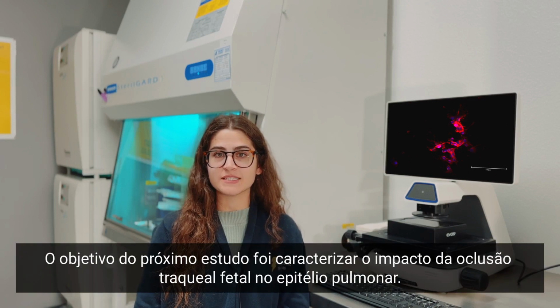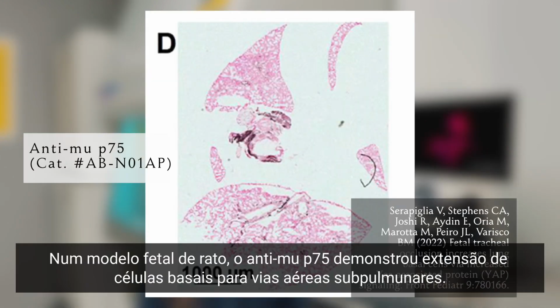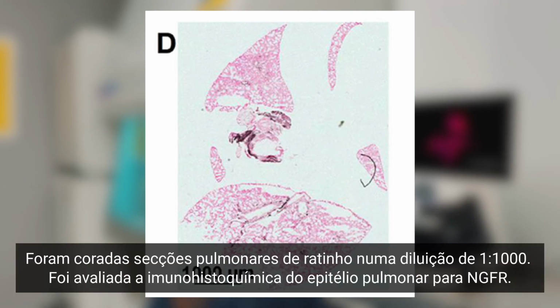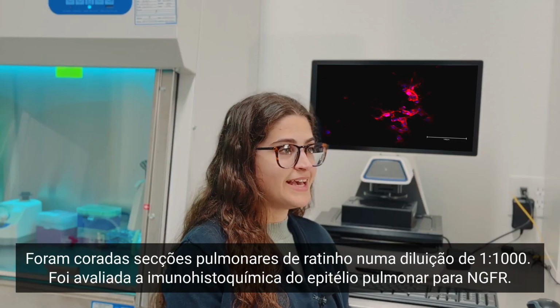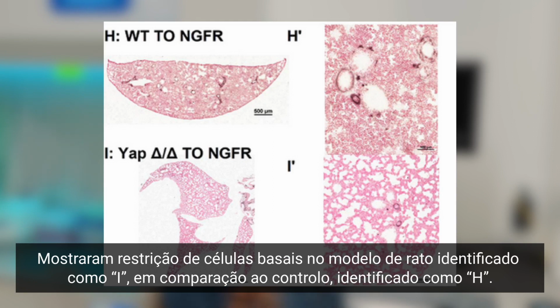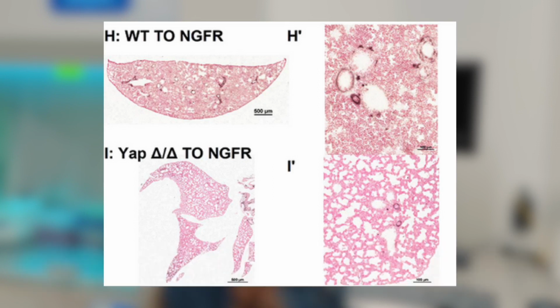The goal of the next study was the impact of fetal tracheal occlusion on the lung epithelium. In a fetal mouse model, anti-P75 demonstrated basal cell extension to subpleural airways. Mouse lung sections were stained at a dilution of 1 to 1000. Immunohistochemistry of lung epithelium were assessed for NGFR. They showed restriction of basal cells in the mouse model labeled as I as compared to control labeled H.